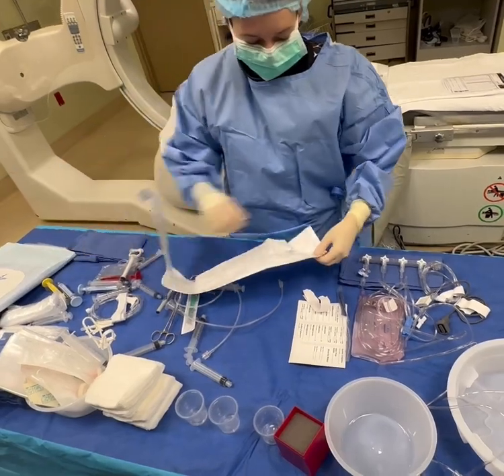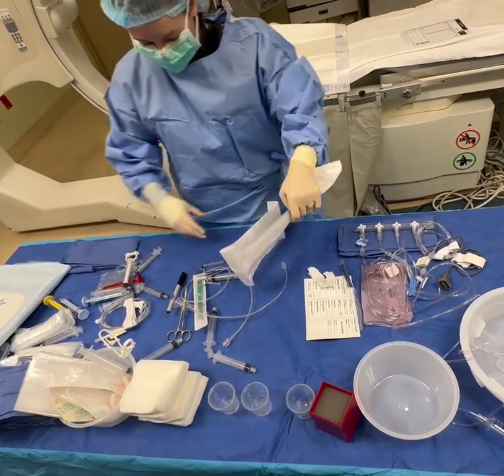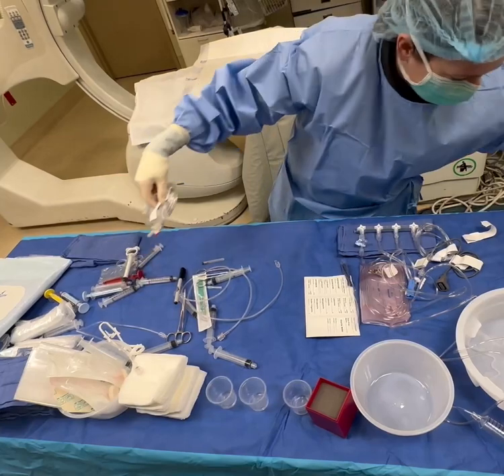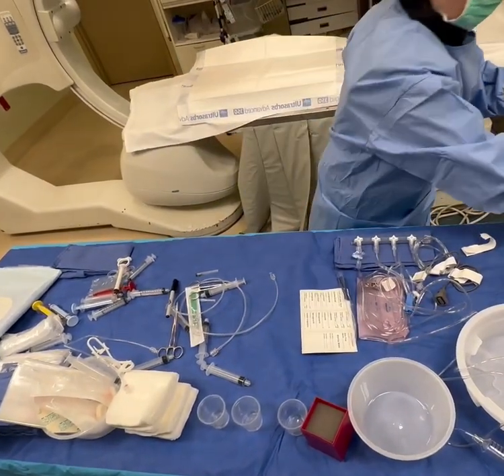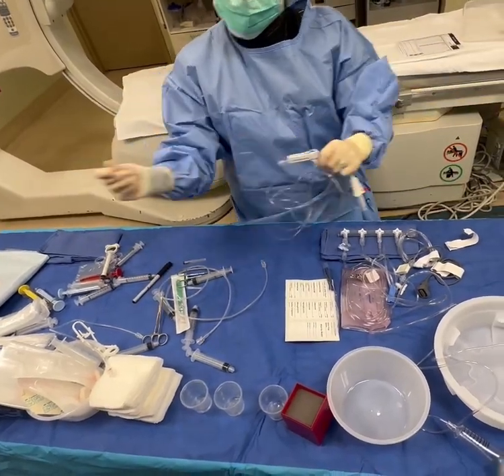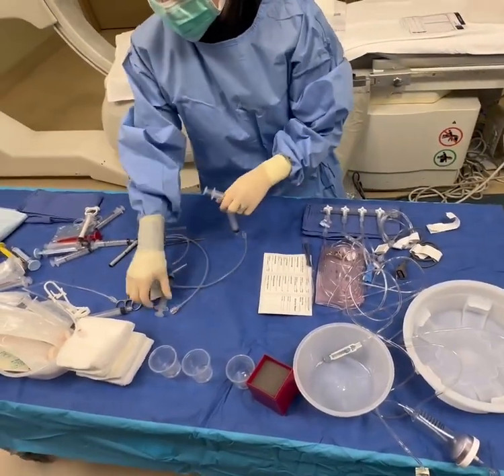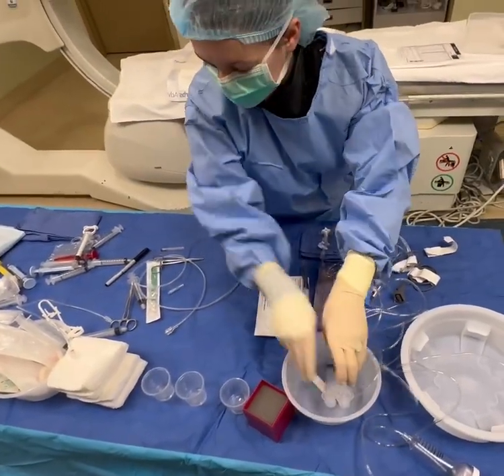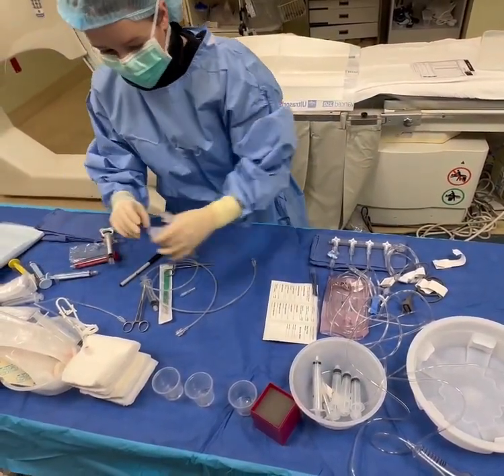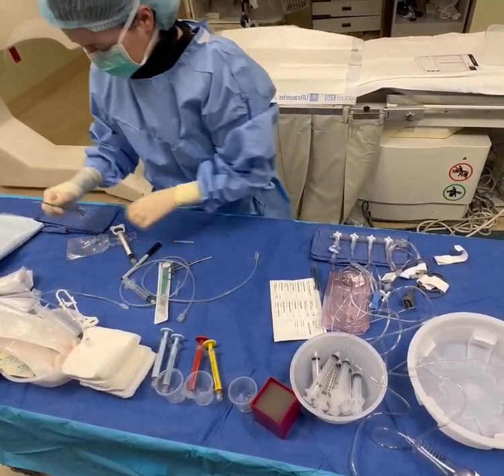This is your extension tubing to the end of this port. It gives you a little more leeway between you and your patient when it's connected to your catheter. You can go ahead and open that and pull that out. This is your drainage syringe for your heparinized saline bag. I'll hand that there for my nurse too. And then I'm also going to put a bunch of syringes in here. Nothing's labeled yet because I don't have any medicines or any fluids poured to label, okay? But I know that I'm going to have lidocaine, probably nitro and heparin.